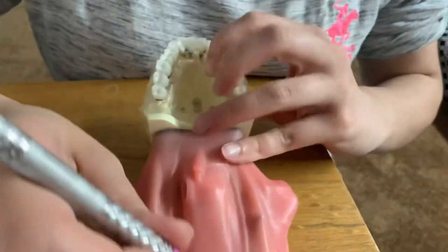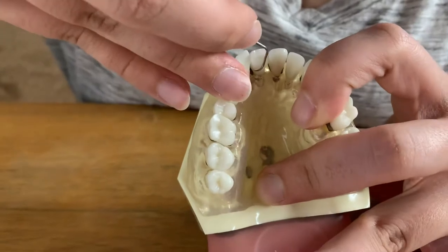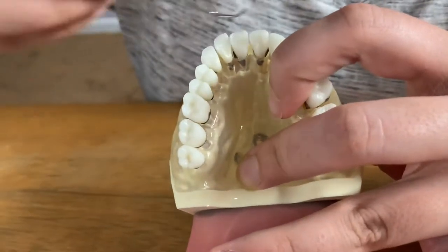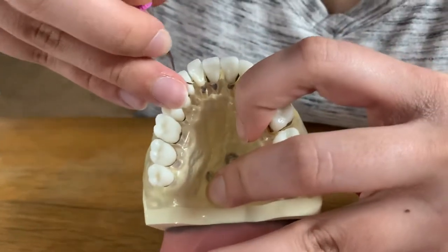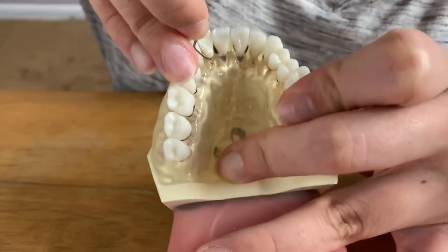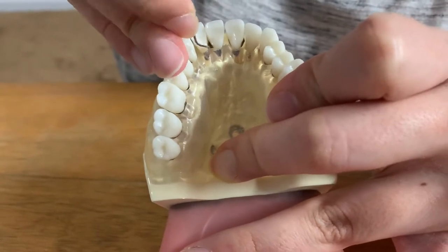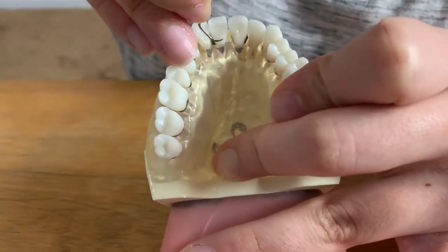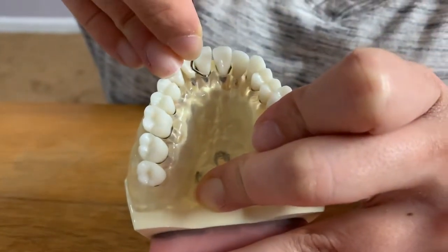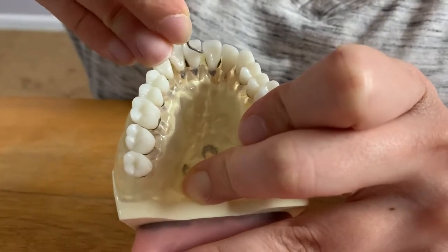Let me actually do the lingual surfaces of these teeth first. I would do the same exact thing over here. We'd have to make sure that we are using the proper side. I'm going to start at the midline again, fulcrum so that we end up interproximally. Starting at the midline again, make sure we have proper fulcrums so we can maintain proper control of our instrument. End up interproximally right there.